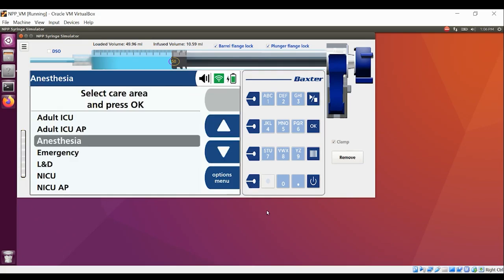And rapid bolus is also available. Let's see, they want it easy to program and intuitive. A lot of anesthesiologists will say, well, let me see your pump. They really don't want you to do a demo for them. They want to see if they can program by themselves. So to that point, it might behoove you to have a library that might have some things already pre-programmed, like maybe you already have a dose pre-programmed in the drug that you're demonstrating, or maybe you already have a weight pre-programmed, because the fewer steps that they need to go through when they're doing their own programming, the happier they are.